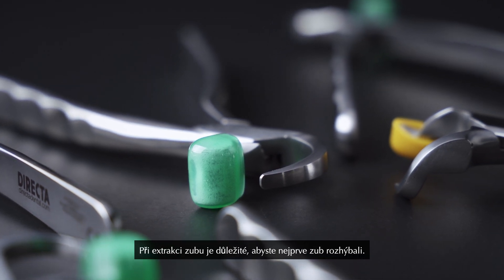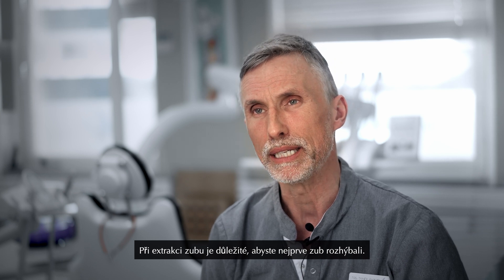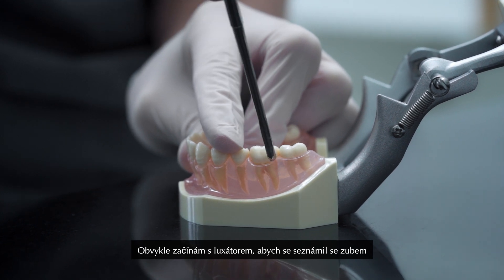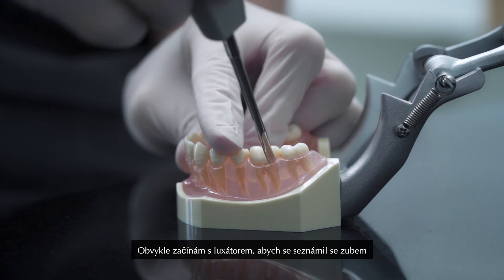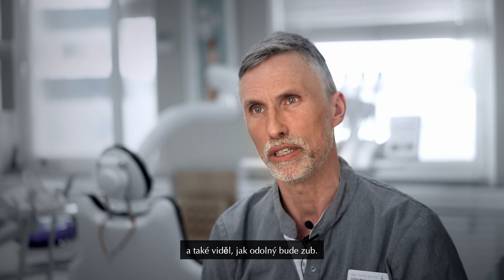When you take out the tooth it's important that you create mobility in the tooth first. I usually start with a Luxator to just get to know the tooth, feel around and see how tough the tooth is going to be.